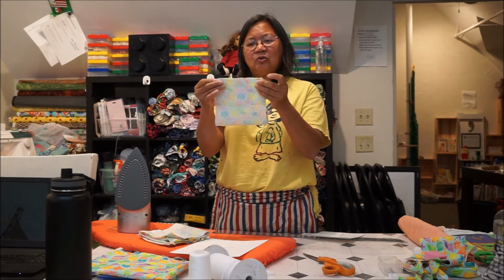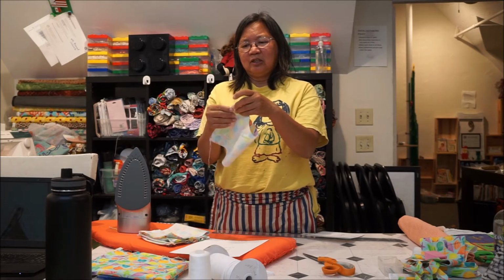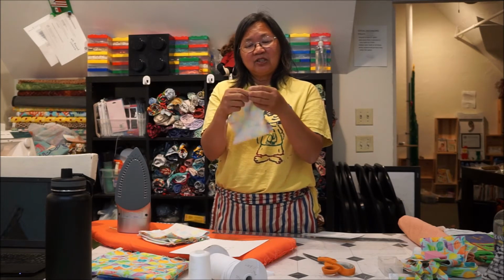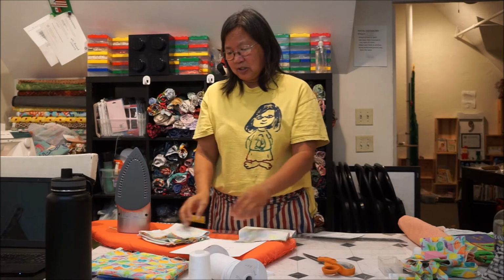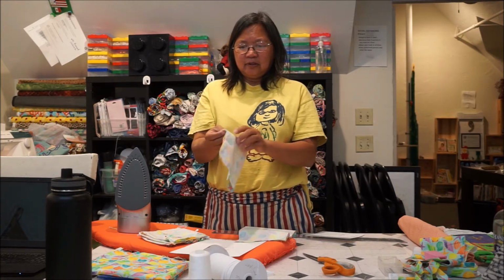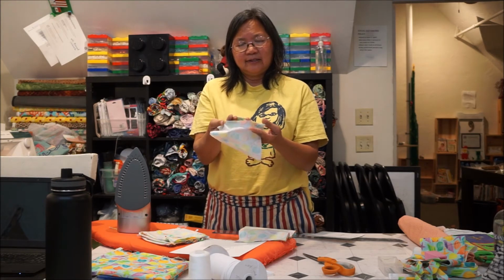Then you fold it like this and you put it in the sewing machine, and you're going to sew about 1.5 inches on either side, and then there'll be a little opening which will be your filter insert. Here I have one that is sewn. So it looks like this.